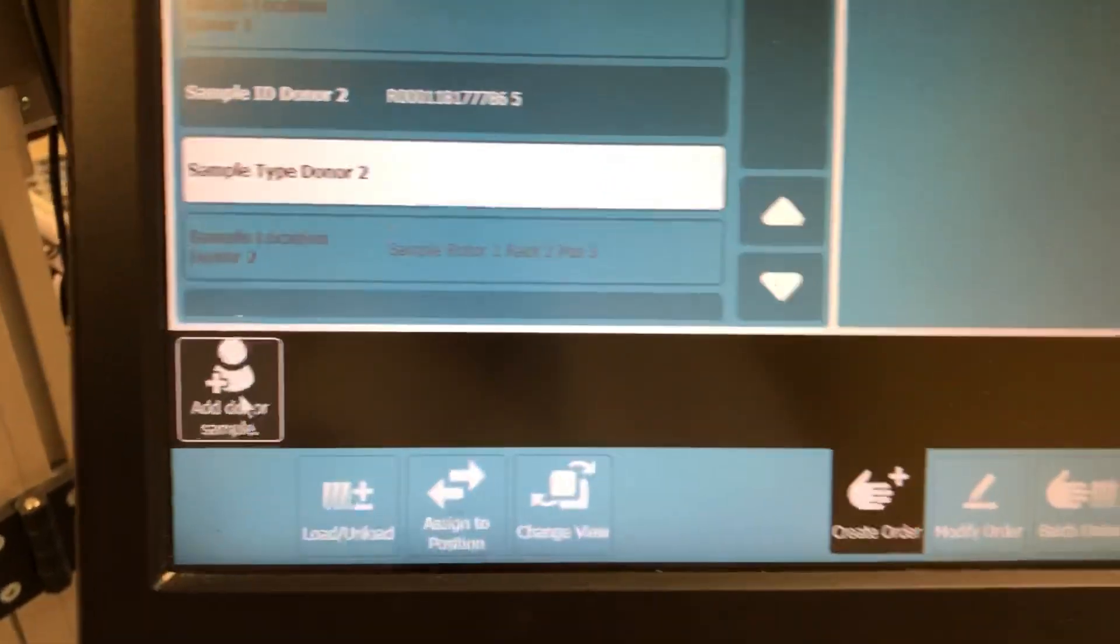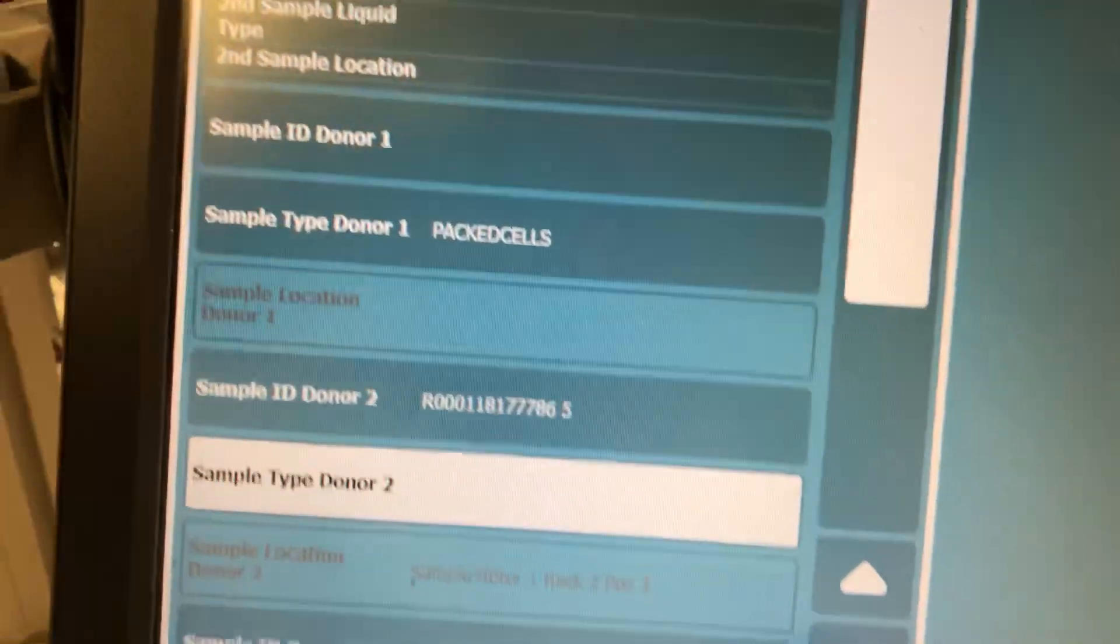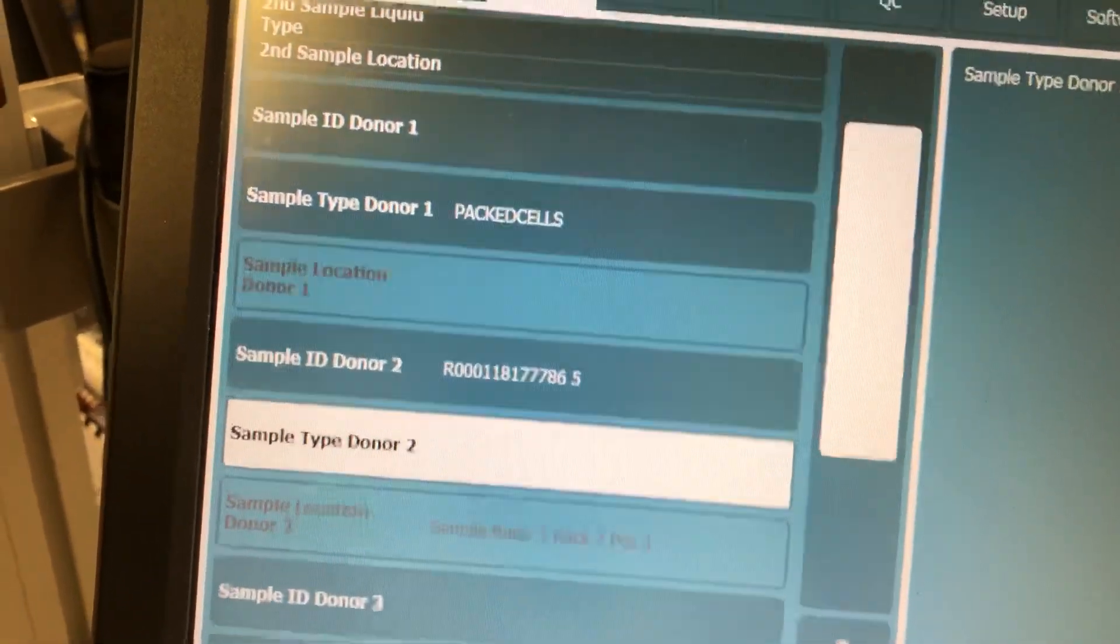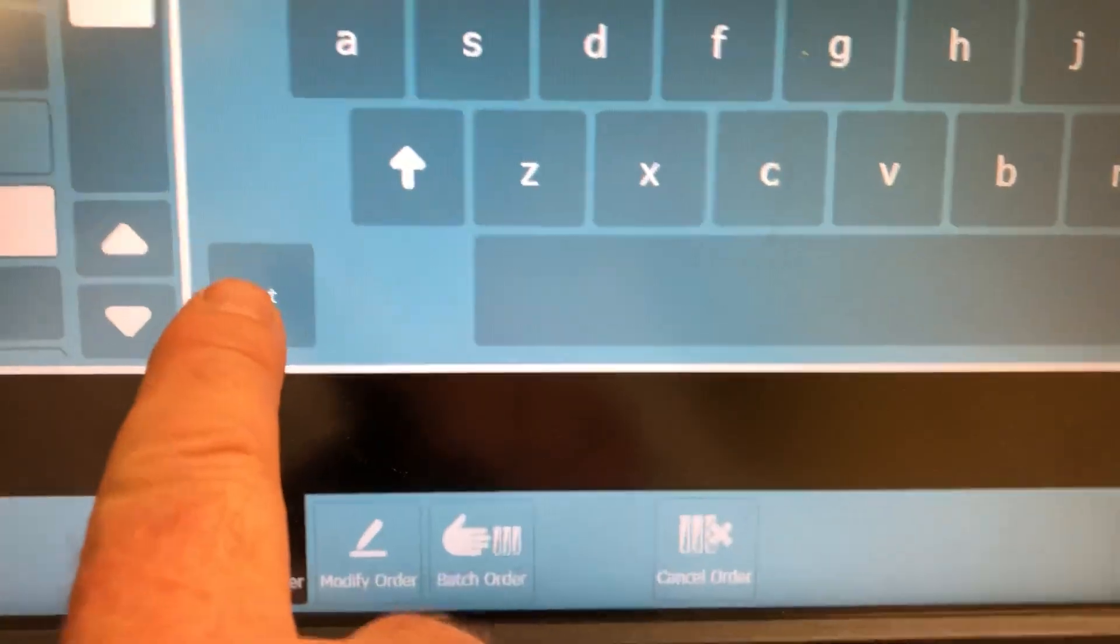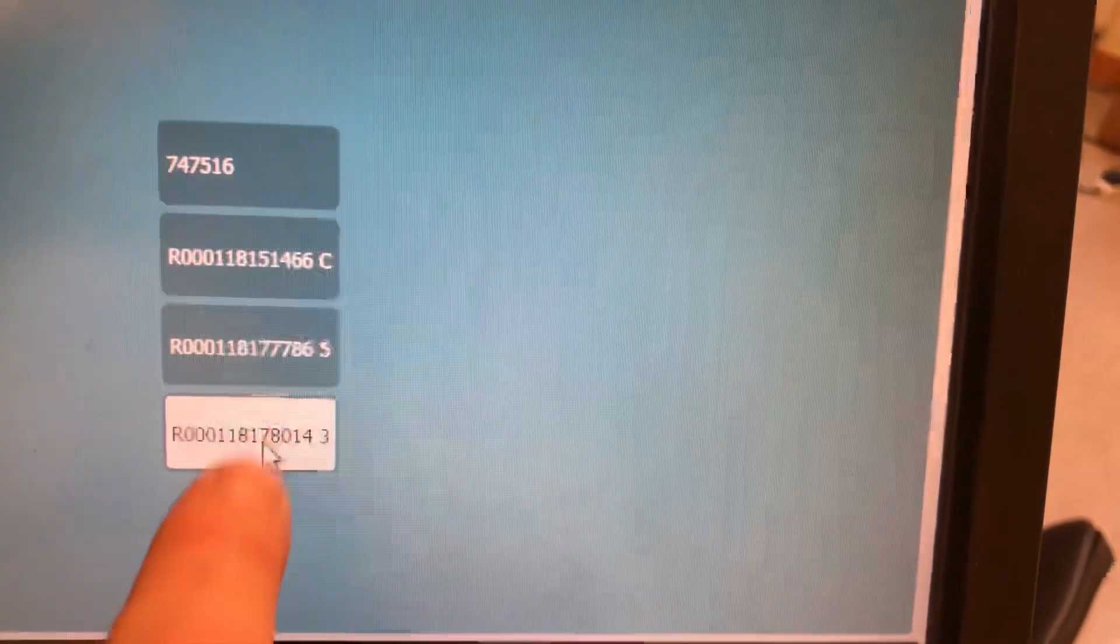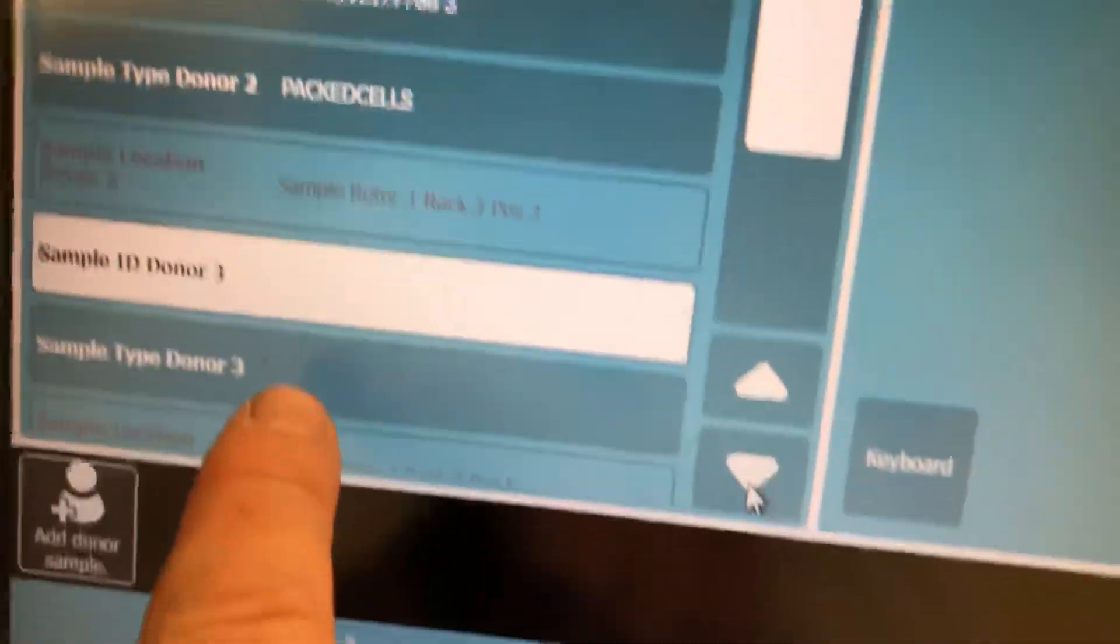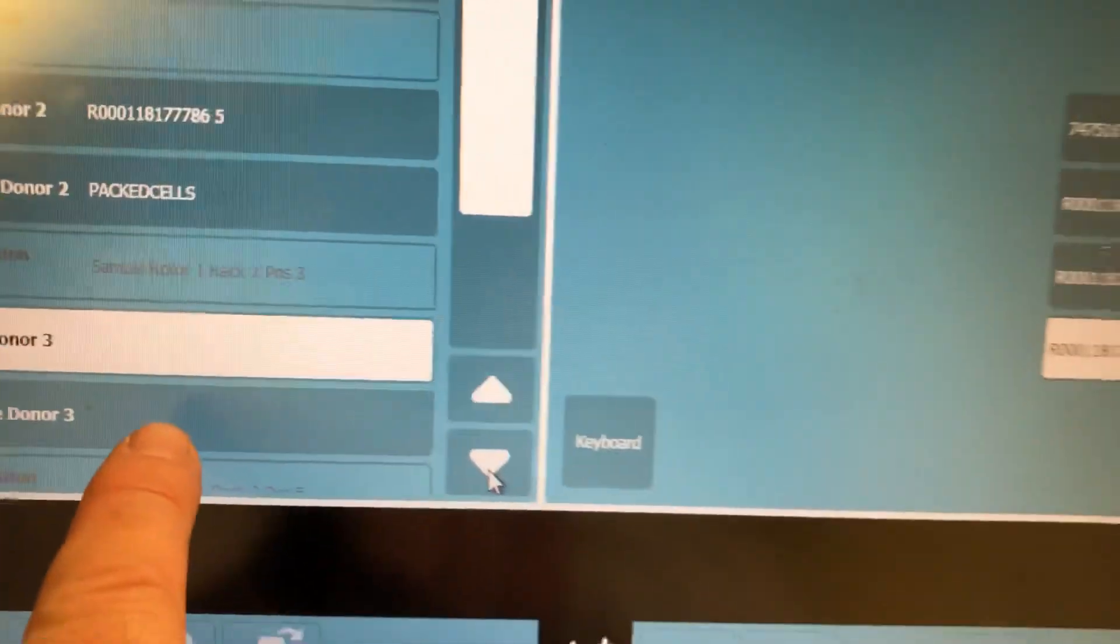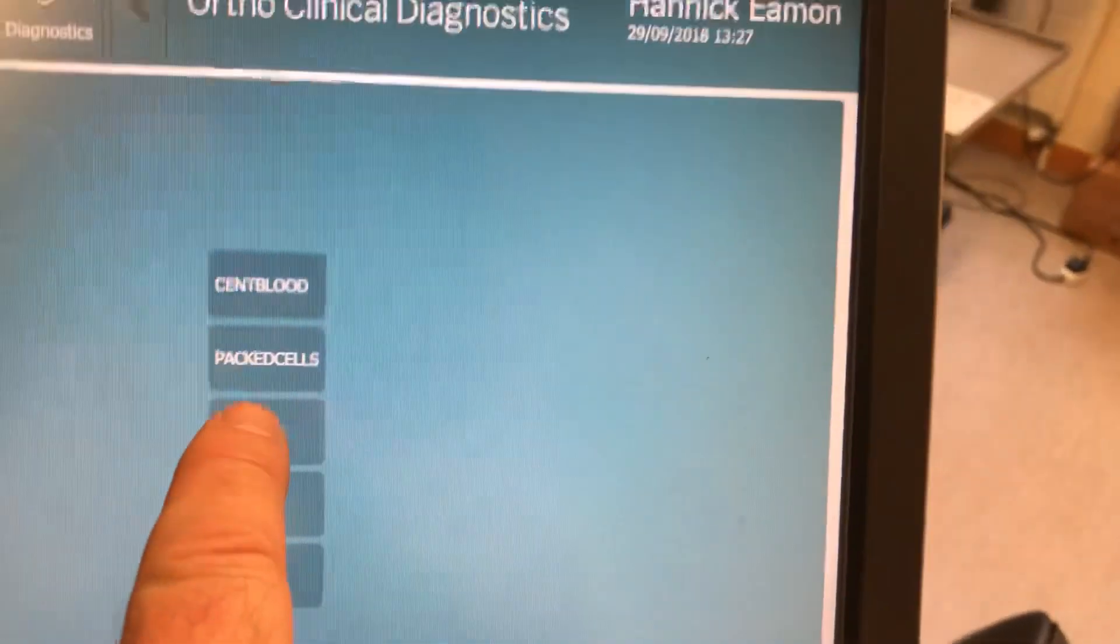I want to add on a third unit. Now you'll notice that I have to scroll down the page to get to the third unit. I highlight it, hit list and select a third unit. And finally I just have to tell it what the sample type is. So I hit this and I select pack cells.